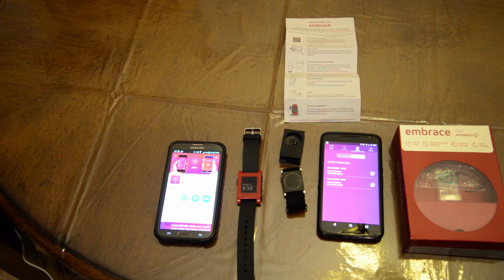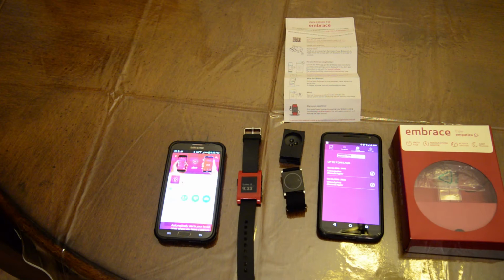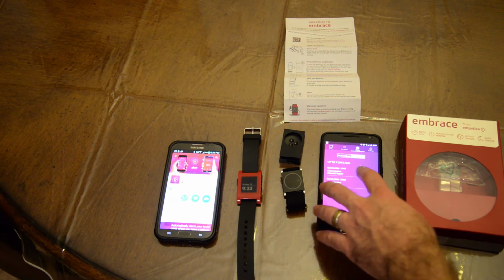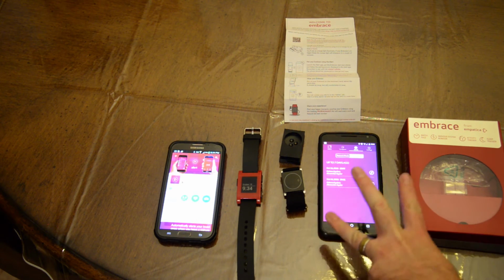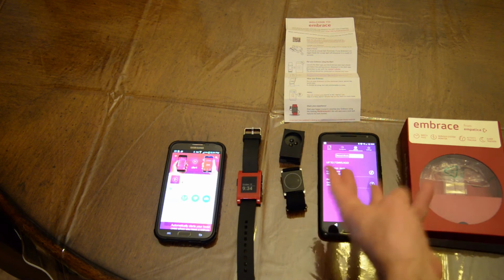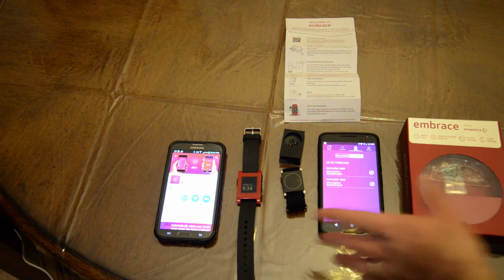I have do not disturb after a certain amount of time, except for people on the special list, like my wife or my relatives, just in case they call me on emergencies. It will go off. I already added the phone number to my do not disturb list, so I will hear it when it goes off, as well as already set the ringtone to that. Not only will you get a call, you'll also get a text, and you'll get an email. So you've got three ways that this thing is going to alert you in order to wake you up at night, or to alert you in any way.